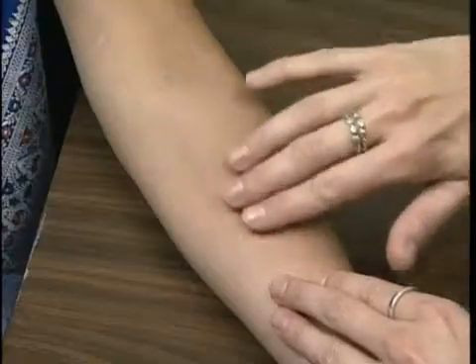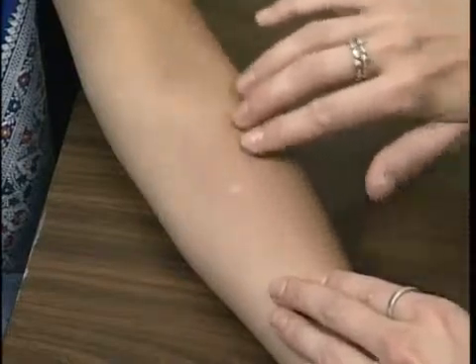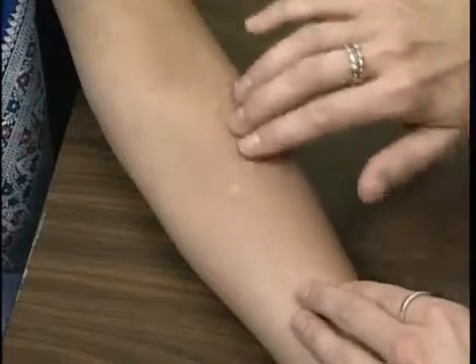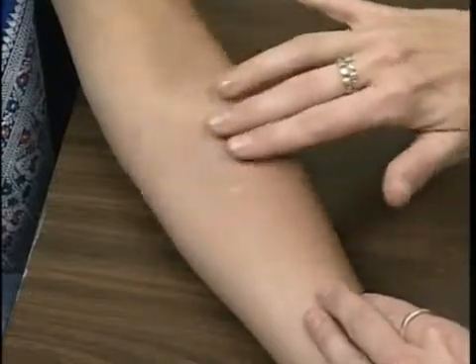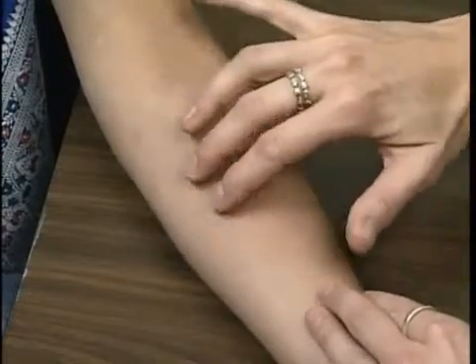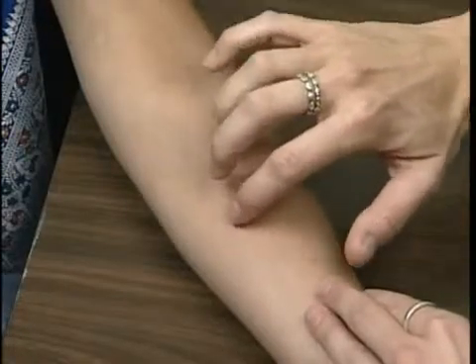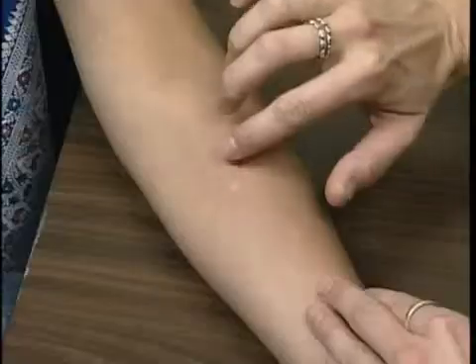Using a light, gentle motion, sweep the fingertips over the surface of the forearm in a 2-inch diameter in all 4 directions to locate the margins or edges of induration. If induration is present, use a zigzag, feather-like touch over the area of induration to outline the margins of induration. Determining margins all around the induration helps to find the edges, which will be measured later.